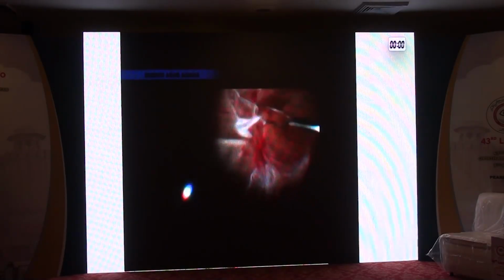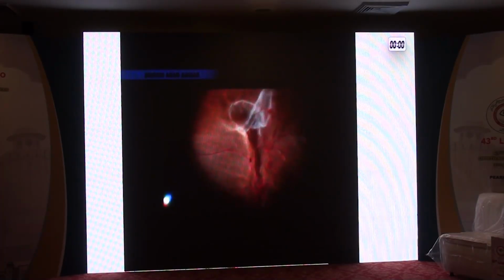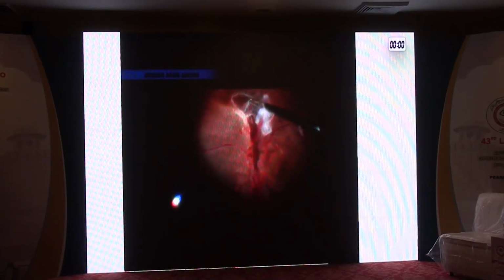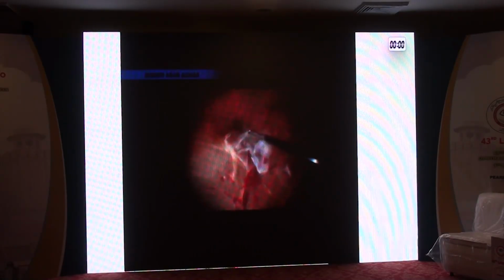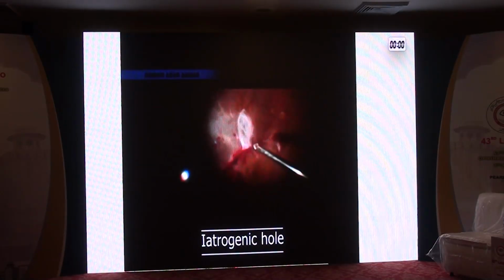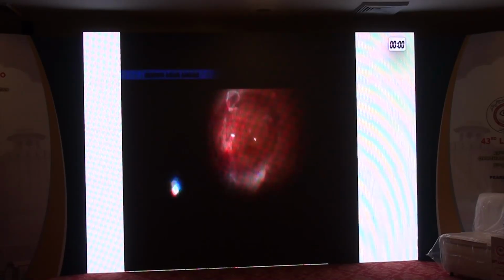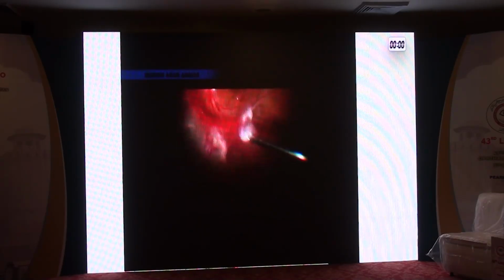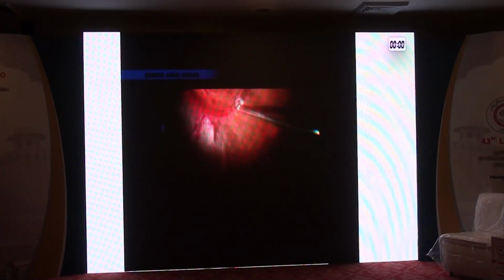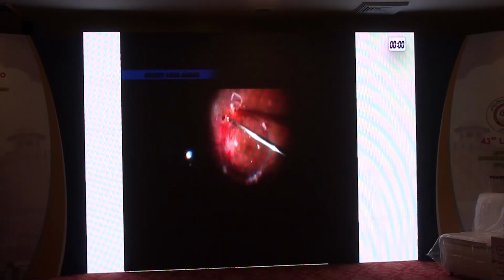It is a very risky procedure. You get overexcited and cause breaks. That is the thing you have to be watchful of. You are working in one place and you get a retinal break somewhere else, really at the weakest point. So I did get a break here, put heavy liquid in to stabilize the retina, removed the remaining FVPs, and did a retinopexy with PRP.